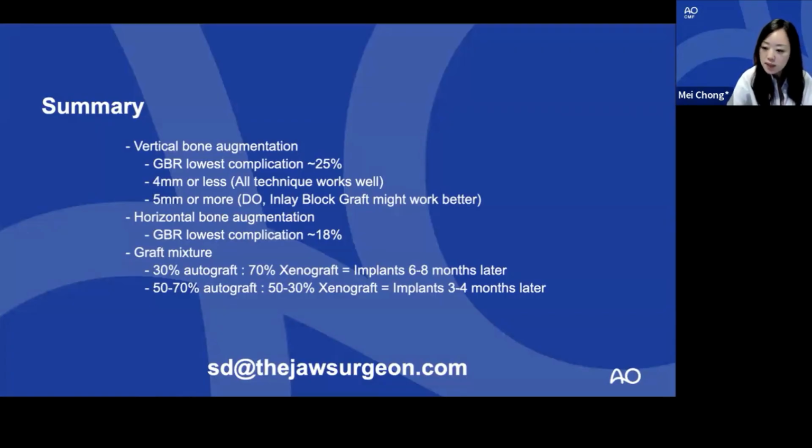So in the meantime, I have a question, Dr. Liu. You seem to be getting most of your autogenous bone grafts from the palatal area so far for the cases that you have shown. And I guess it makes sense because you're working in the same surgical area, so it saves the patient a second wound.